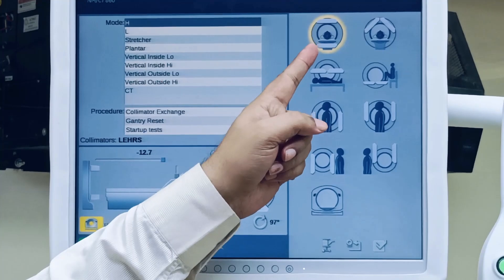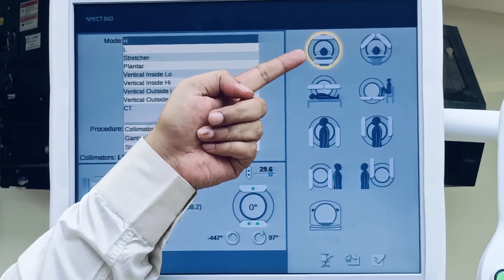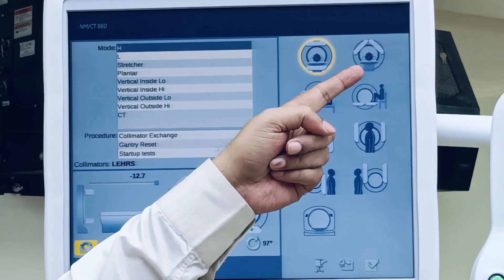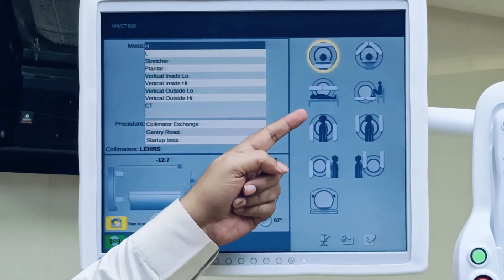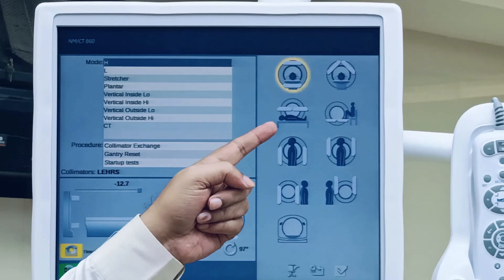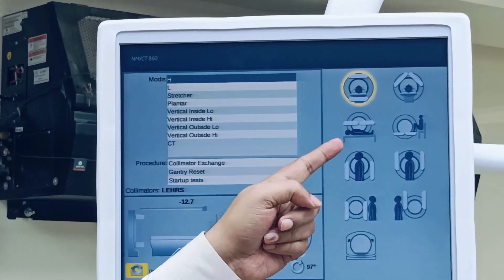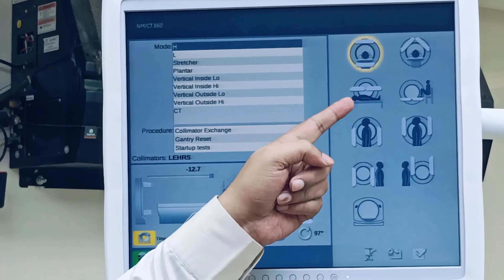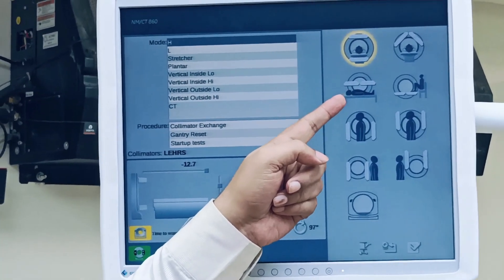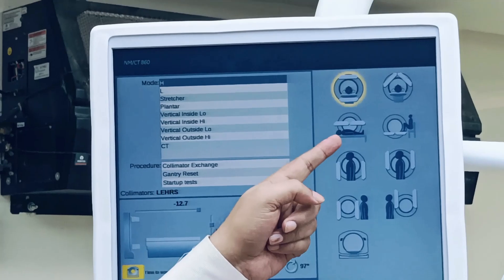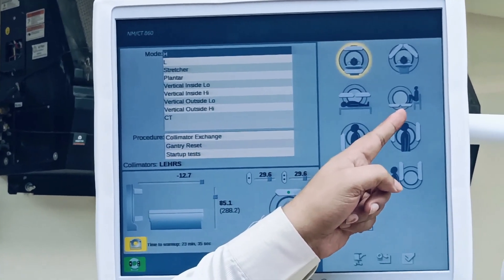These are the graphical presentations of the different gantry modes. Currently it is in H mode. This one is the L mode, and this one is the stretcher mode. If you want to scan a patient directly on the stretcher without transferring them to the table, this is done for ICU patients who cannot be shifted to the machine bed.